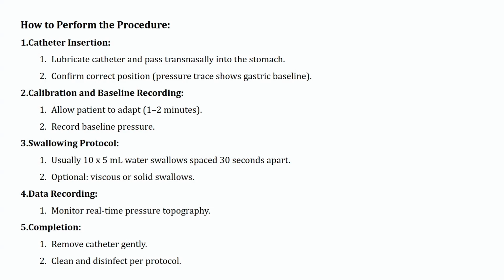But if we have an achalasia case, there is no peristalsis, no contraction. We can see the pan-esophageal pressurization immediately. So after like 15 seconds, we can start to give the patient the second swallow. But anyway, it's better always to keep 30 seconds between each swallow. The first step should be done with wet swallows, and we can also give the patient viscous or solid swallows. It depends on the case.